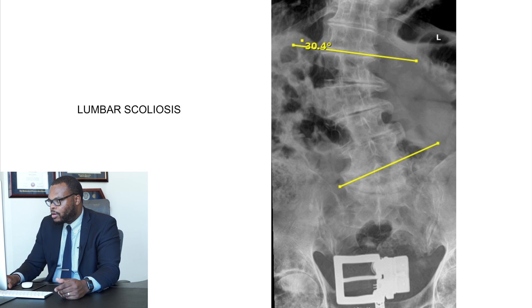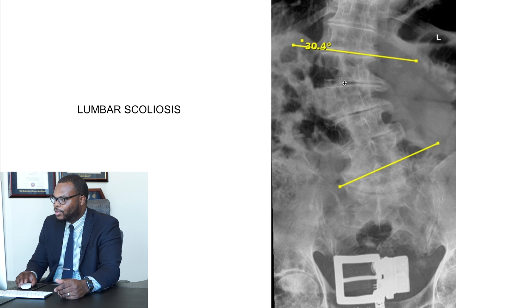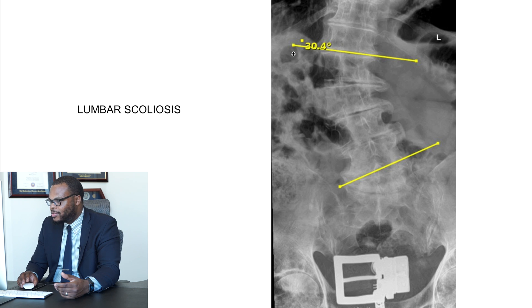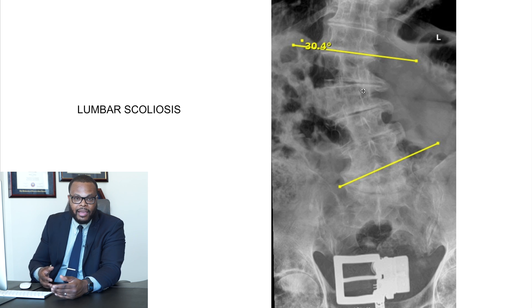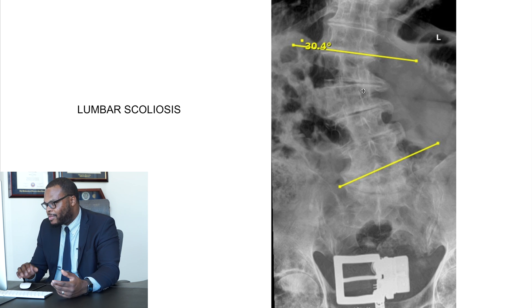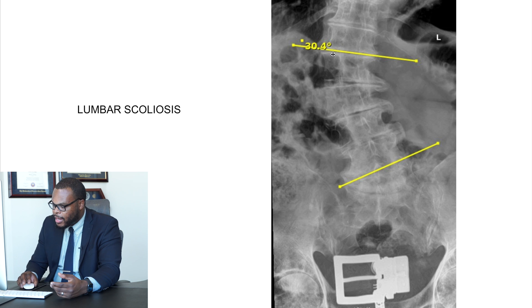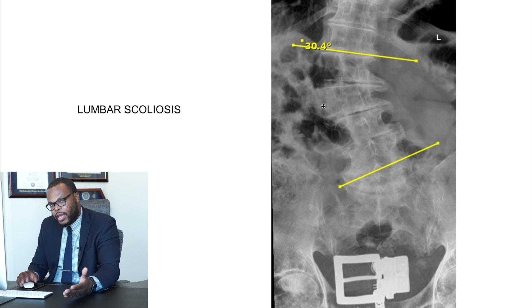This is a lumbar scoliosis. This patient has about a 30-degree scoliosis going to the right side. This can certainly press on some nerves and cause compression in the spine that can shoot pain down the legs when they walk, causing a lot of back pain. But a lot of patients with lumbar scoliosis can be treated conservatively. Just because you have scoliosis doesn't mean you need surgery — most of it can be treated with conservative treatment unless those things fail.